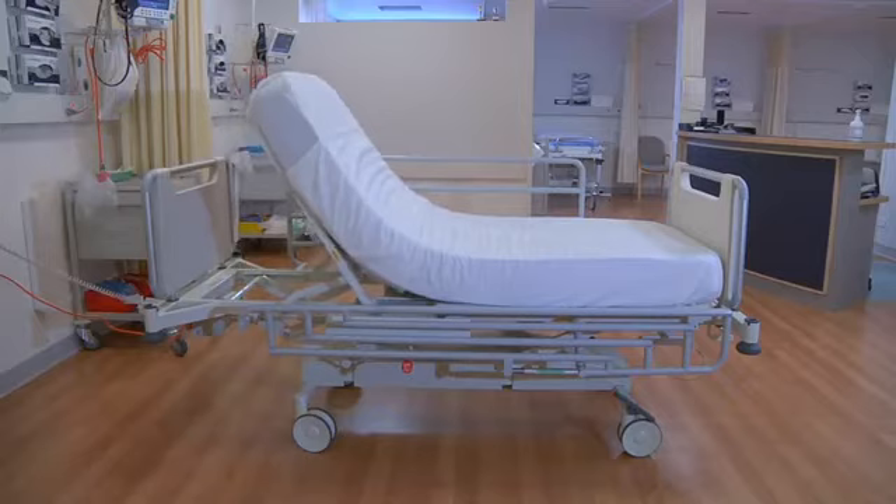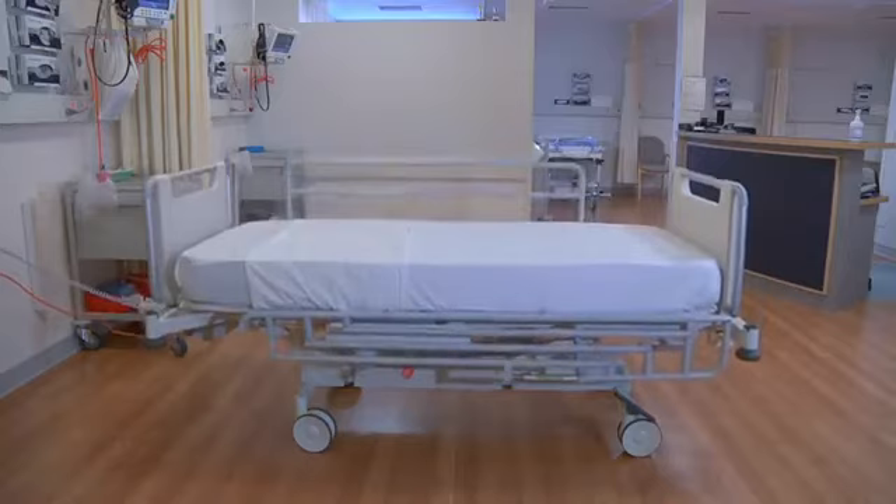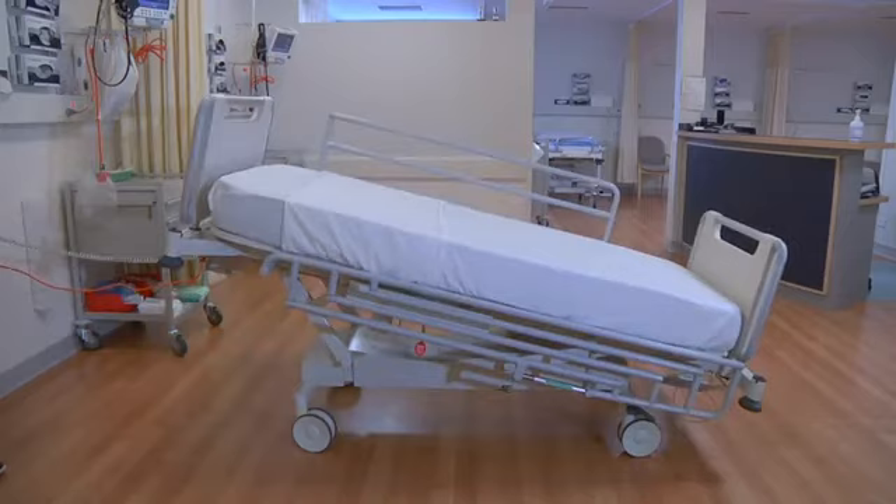The M9 is simply one of the most functional and well-designed ward beds on the market. That's because it has been designed for everyone who comes into contact with it, from patients to orderlies to medical professionals. When it comes to Howard Wright's range of award-winning medical beds and stretchers, it's all about making human care easier.